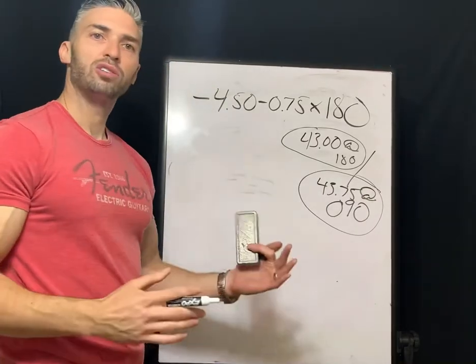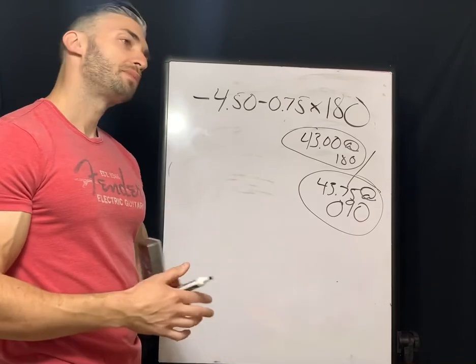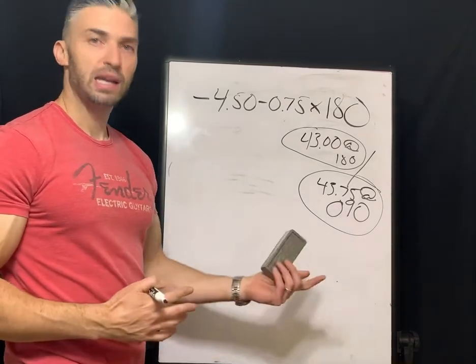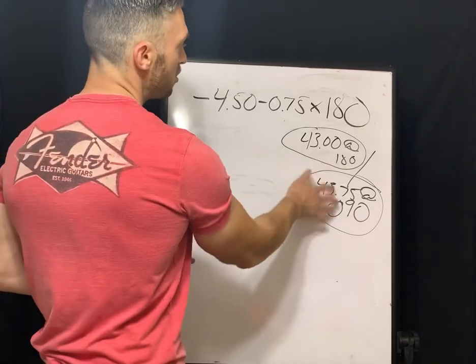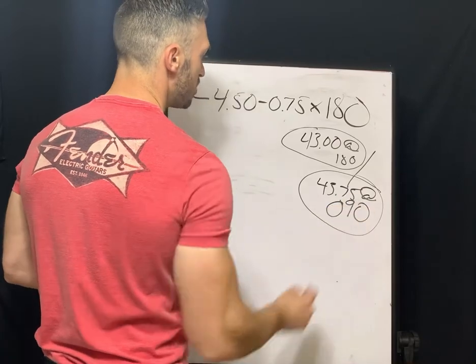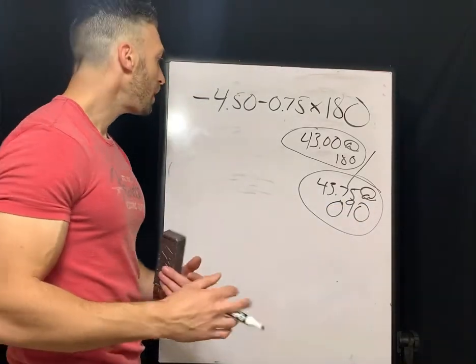Remember, if you have regular astigmatism, these are going to be 90 degrees apart. Irregular astigmatism, like a keratoconus patient, your steepest and your flattest meridians are not 90 degrees apart. But this is regular astigmatism. We see that it's steeper along the 90 degree meridian. So we know that it's with the rule astigmatism.